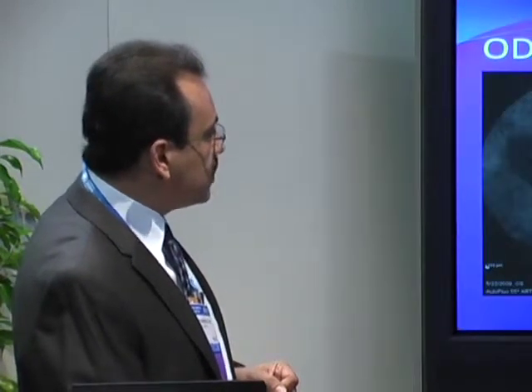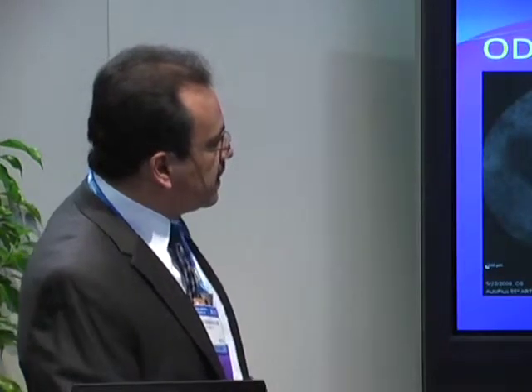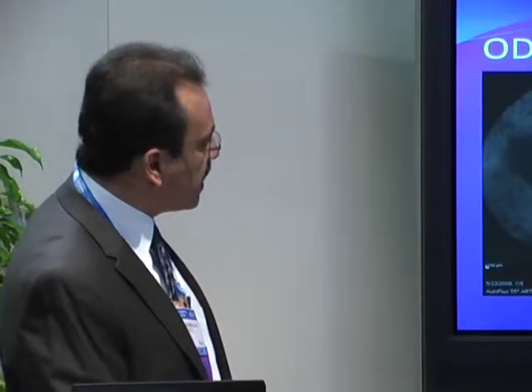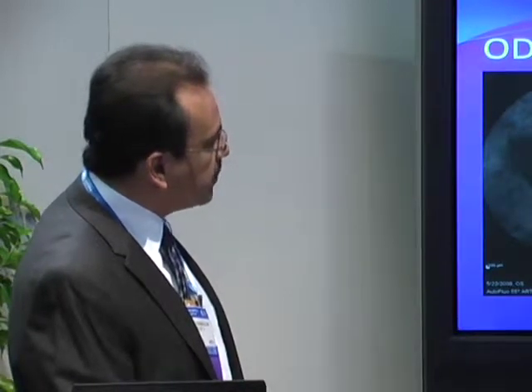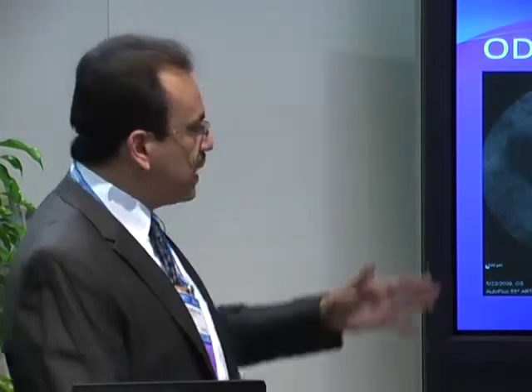Let me just go, from a study standpoint, for those of you who have heard Alan Bird and Frank Holz talk about autofluorescence, and I want you to see how nicely you can correlate the activity. The dogma is that if you have these rings of hyperfluorescence in patients with RP, typically what that implies is that that's a border or a zone of functional or more functional photoreceptors versus areas that are more atrophic. And you can demonstrate this with your MP1.